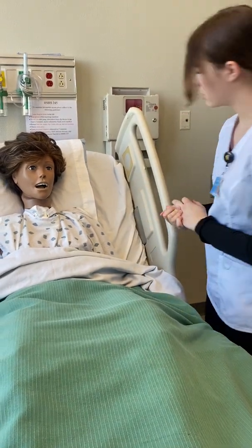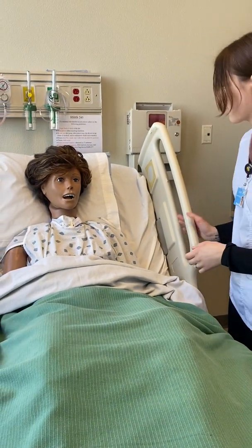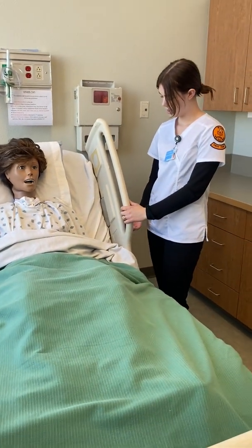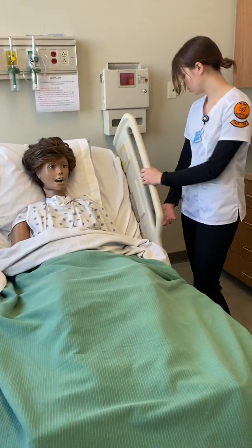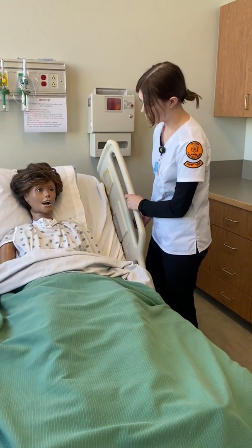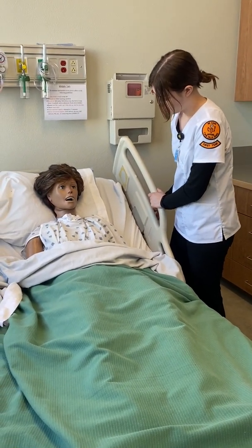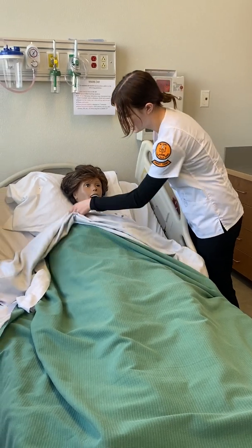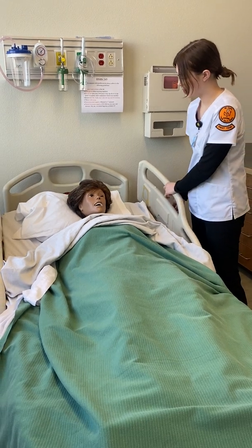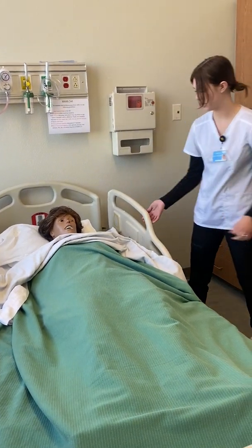But that's it. How are you feeling? Any pain on a scale from 0 to 10? No? Okay, I'm gonna go ahead and lower your bed again. And you might be a little bit uncomfortable for a little bit just since we did just take that tube out. And then I'm just gonna lay you all the way back. Here's your call light. And then if you have any questions, I'll be in a little bit and I will let your doctor know that we got that tube discontinued.